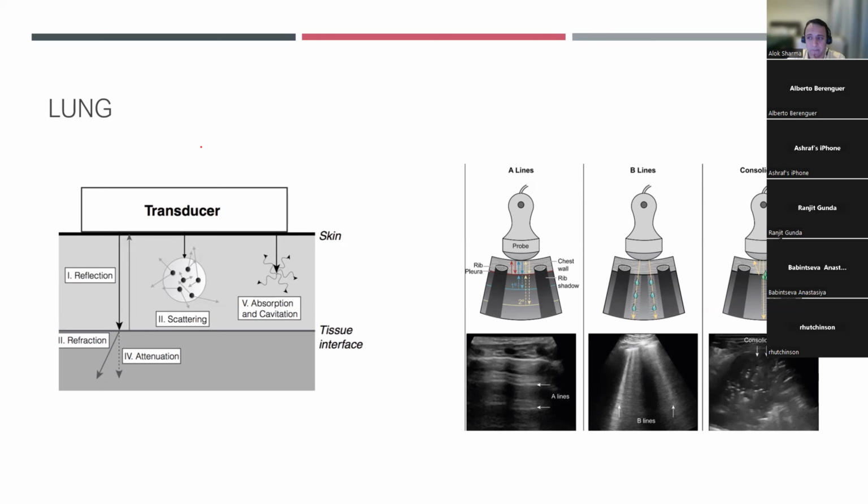So I want everybody to write yes in the chat box to say that they've understood the basic principles of how an image is generated, that they understand the concept of frequency and amplitude. These are the two most important objectives from these initial slides. If you have not understood this, then I need to go through this again. And I cannot emphasize enough how important this is.